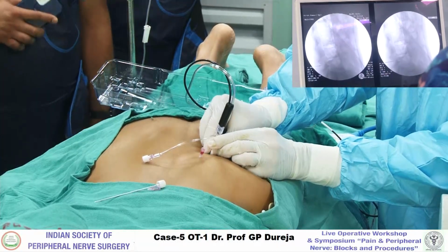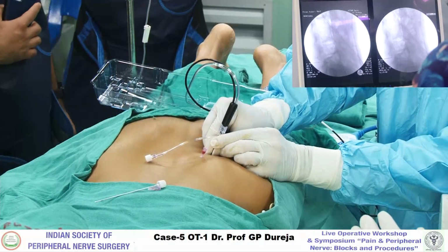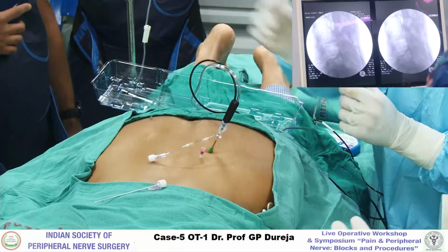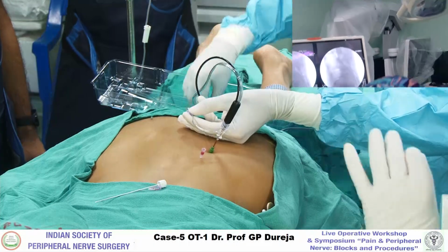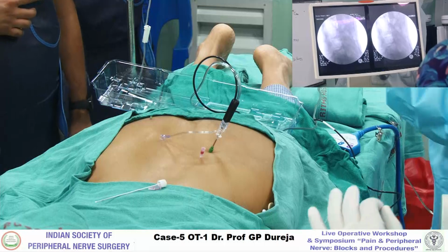Absolutely. No, to the bone. Here the nerve is not in. Sorry, to the bone. Now it's 630. This is fine. In the interface between the bone and the needle we can put some saline to see the interface.